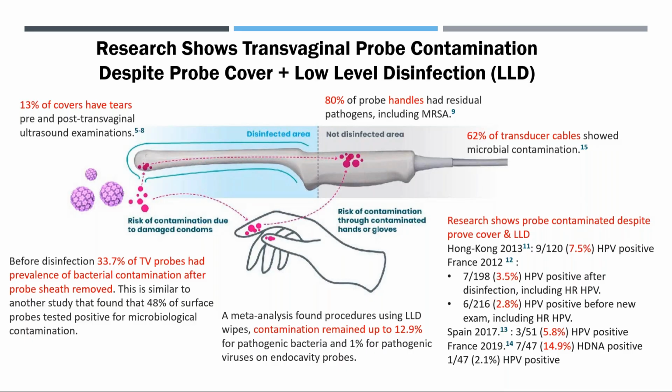And there are many studies out there showing that despite probe covers and low-level disinfection, pathogens remain on the probe.